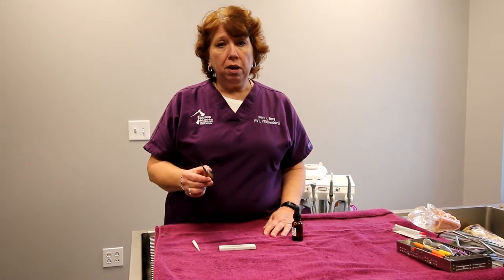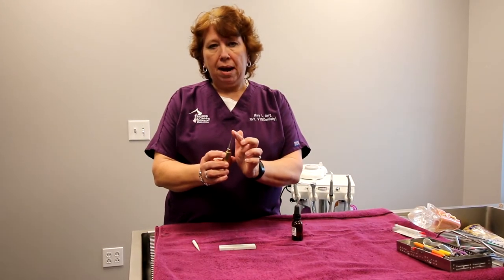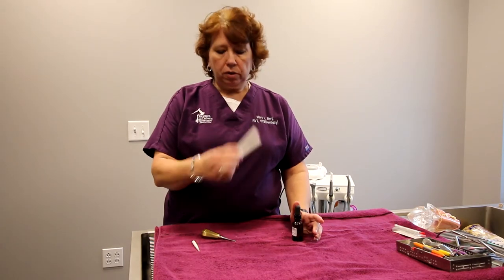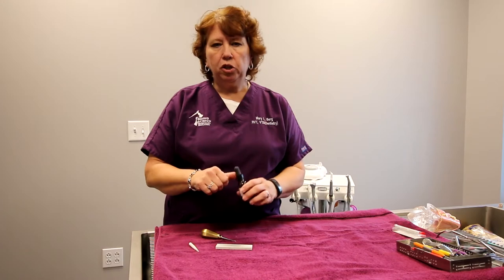It's really simple to sharpen an elevator. All of our elevators have a little bit of a bevel, kind of on the back aspect of it. So just be aware that there's that little bit of a bevel. We're going to need a flat Arkansas stone and a conical Arkansas stone, and just a little bit of sharpening oil.